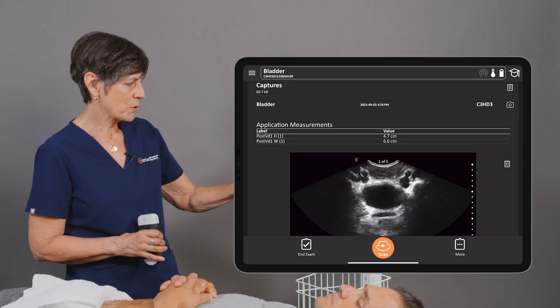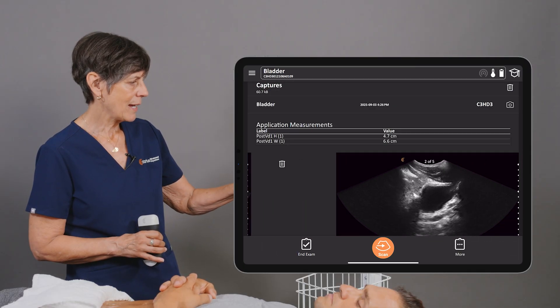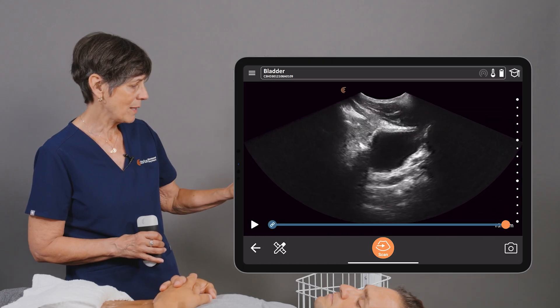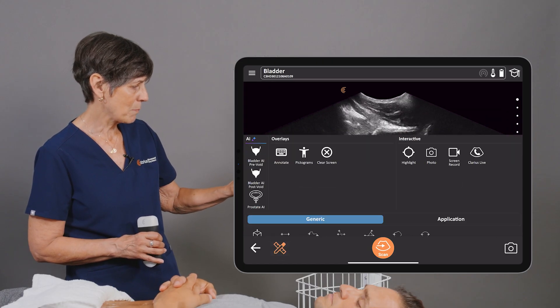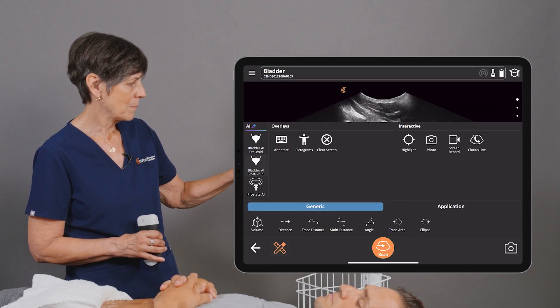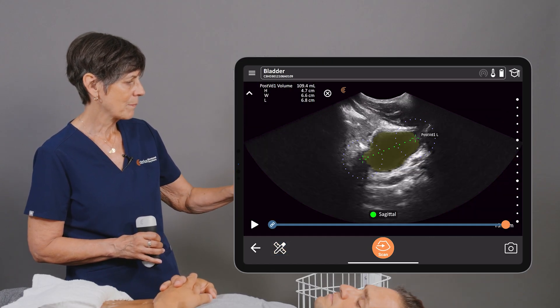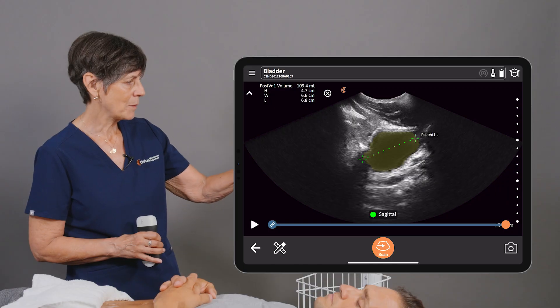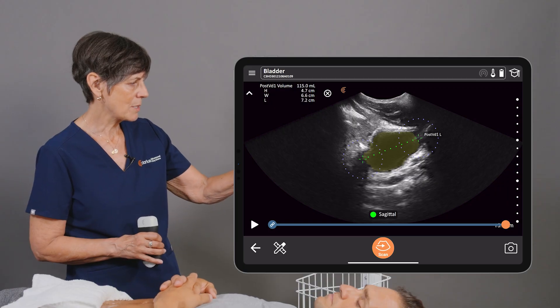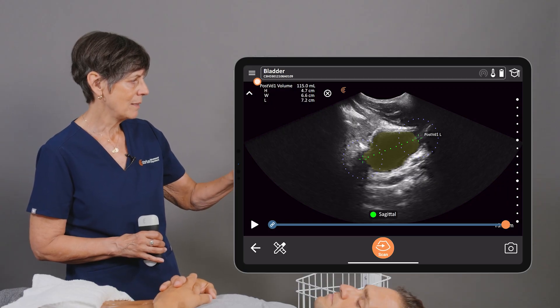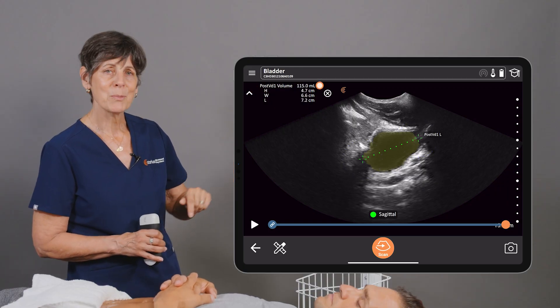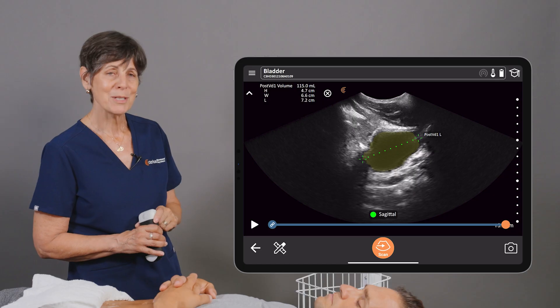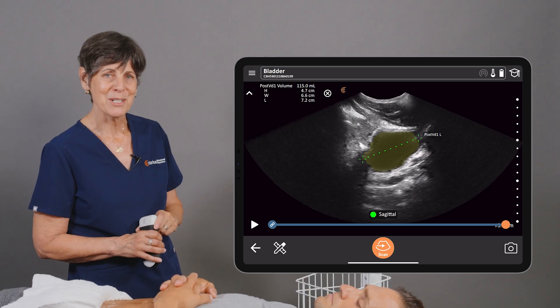We'll just exit full screen, and then we can go to the next image as well. Do the same thing. Let's label this sagittal. I'm going to adjust that one just a tiny bit, and we're getting our post-void residual volume on previously stored images.